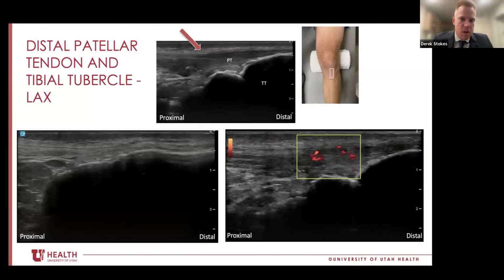For the distal patellar tendon, this shows more of the same, with the arrow pointing to an area of thickening and hypoechogenicity, but also some new findings: a little bit of cortical irregularity at the insertion, along with some hyperechogenicity just proximal to that, indicating some probable dystrophic calcification, supporting that this is a chronic process and has been ongoing for a long period of time.